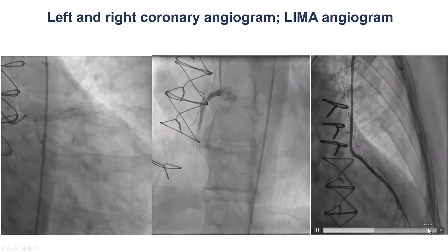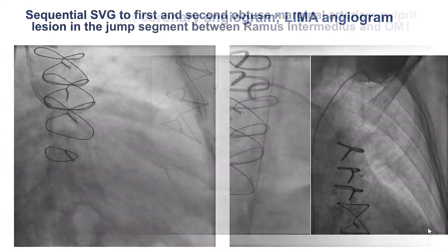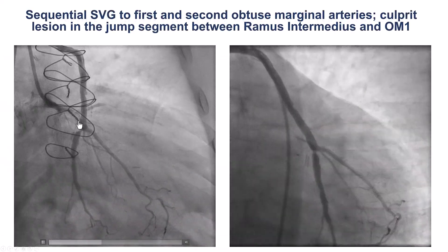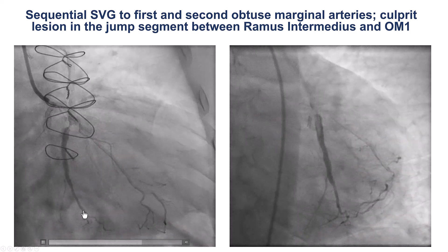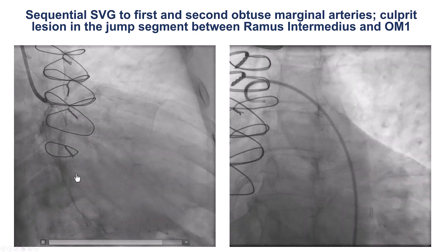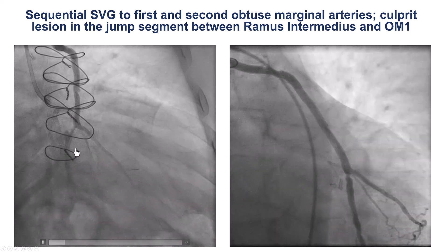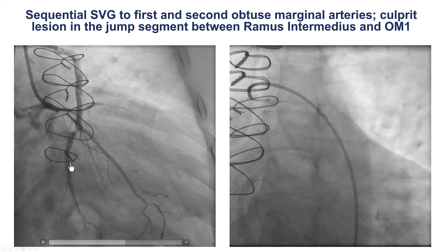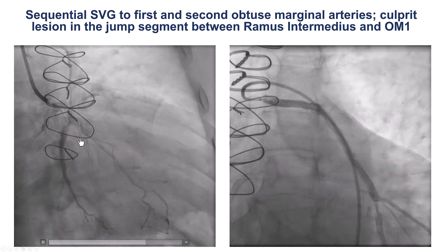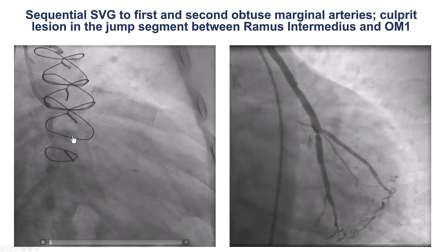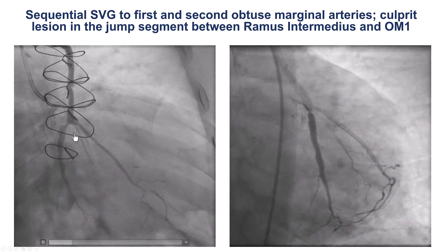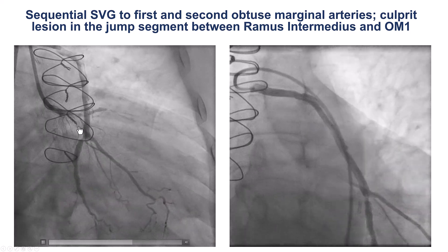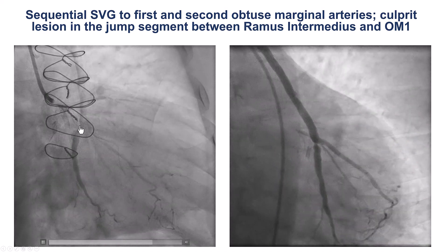There is a patent LIMA-to-LAD. The culprit lesion is the sequential SVG to the RAMUS and to the first obtuse marginal branch. The previously placed stents are in the skip segment of the graft, and the culprit lesion is just proximal to the previous stents at the touchdown of the sequential SVG down to the RAMUS branch.